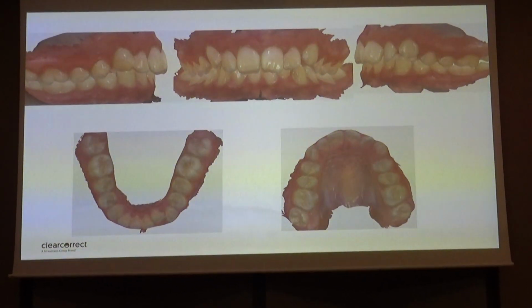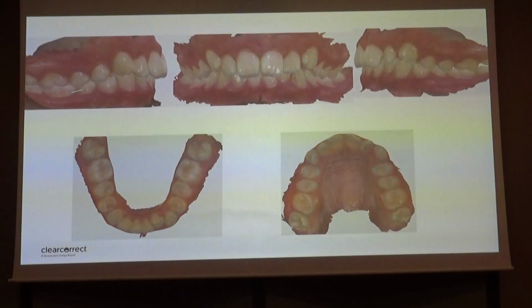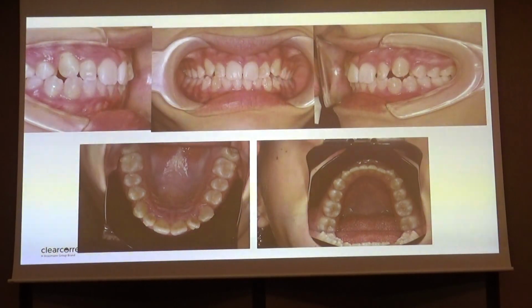Another situation where we are doing the sequential distalization in the upper. And look, where is the diastema now? And look at what's the type of the engager and the position of the engager. So I need to tilt distally this canine.